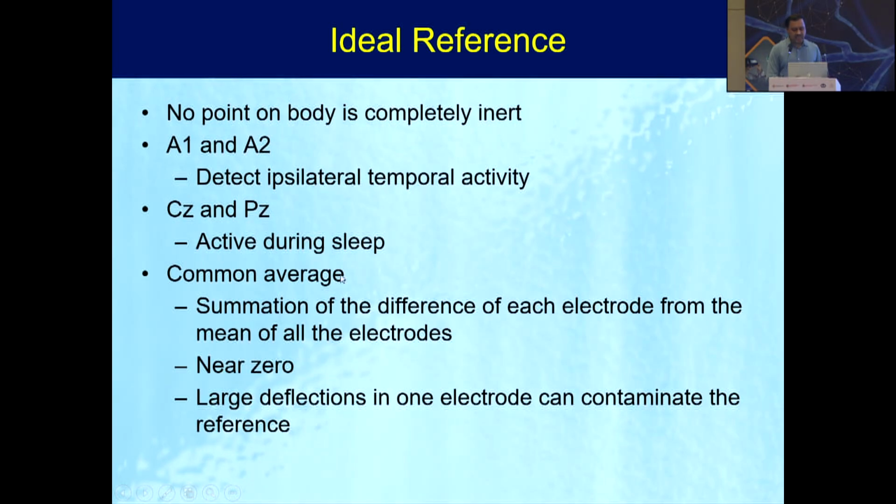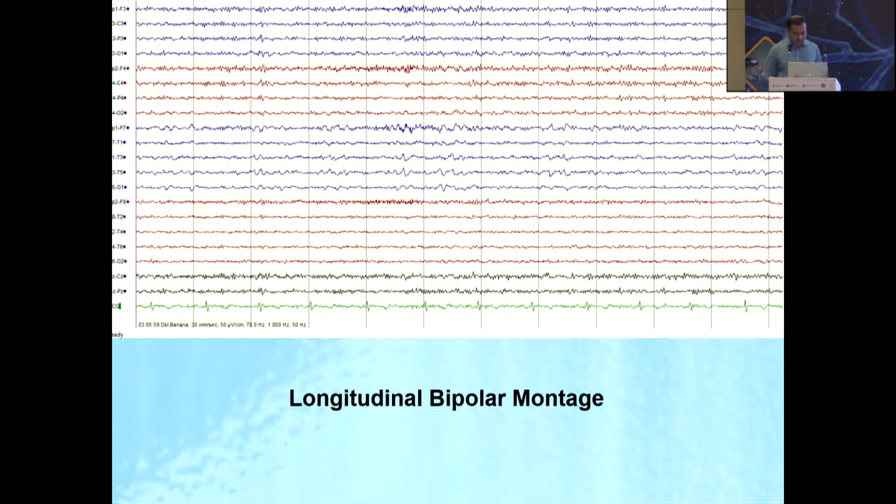So what happens is, suppose you take 10 electrodes in that reference, and you combine the potential of all the 10 electrodes. Let us say each electrode has a potential of 10, so you combine 10 plus 10 and so on, and it becomes 100. Now you take the mean of that, which is again 10, and from that mean you subtract the individual electrodes, so 10 minus 10 becomes 0. This is how it is calculated mathematically. The computer does it for you. But this is a case where you can have the potential of that particular common average reference be as 0 as possible.